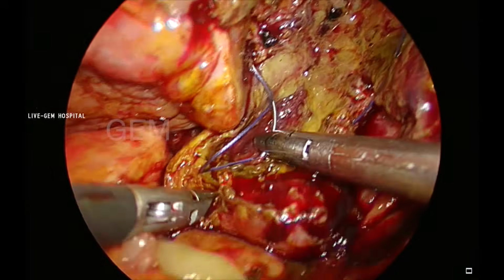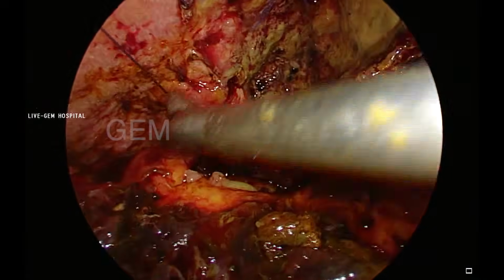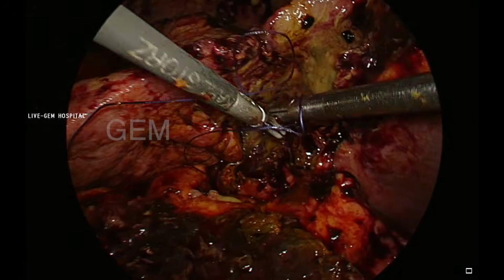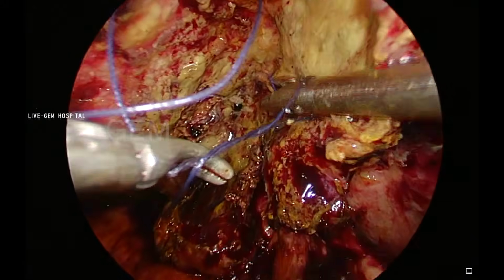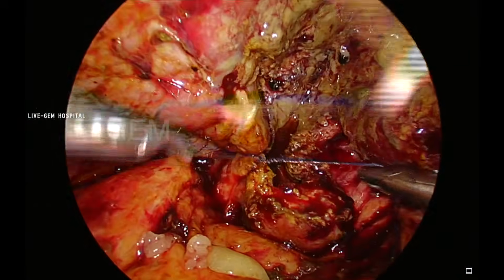So I'm taking deep stitches. It includes the posterior wall of the gallbladder and the infundibulum both. I'm using a 2-0 Vicryl suture to close the infundibulum.